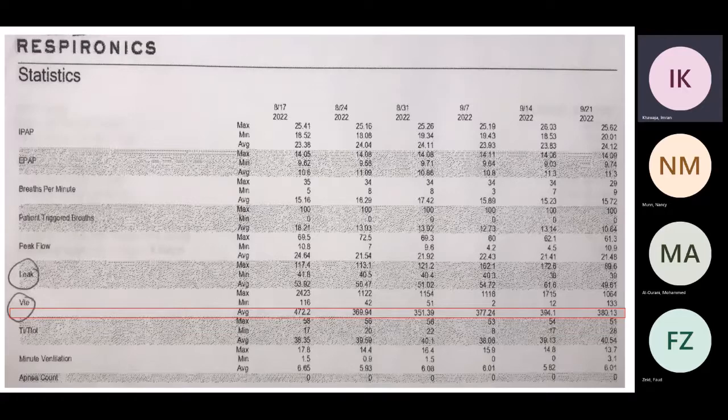So you're telling us if everything is correct, you don't think that you need to. I mean, in general, not in this patient. In general, if everything is correct, you don't expect every patient to reach the maximum all the time, right? Correct. So if they reach it all the time, they mean okay. Or maybe at least leave the patient with a little bit of room for more if needed.